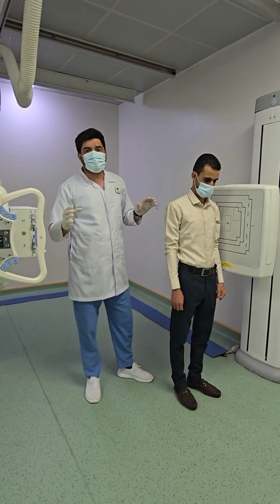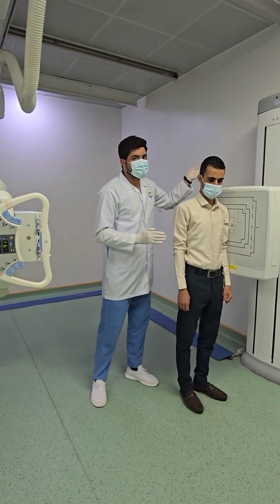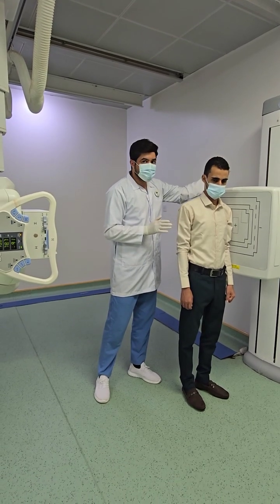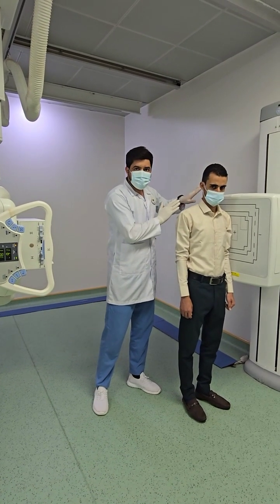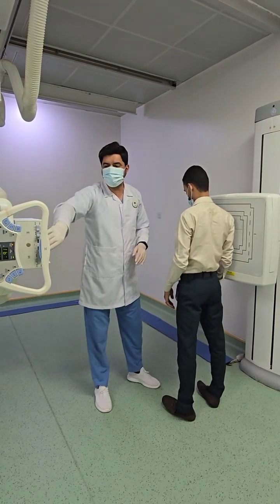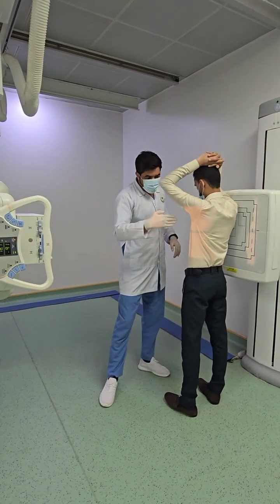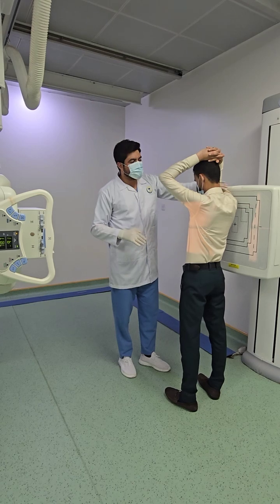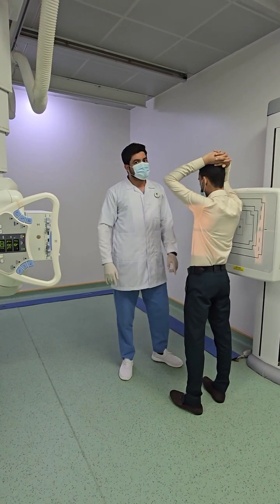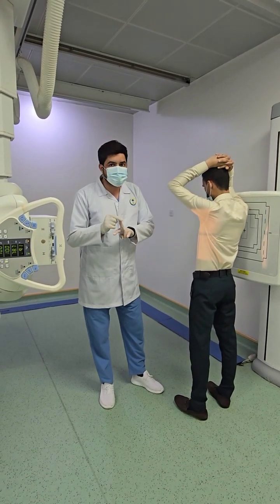X-rays will enter from one side of the body and will emerge from the other side of the body. Either it will enter at the right side of the body and will emerge at the left side of the body and then will interact with the detector, or the X-rays will first interact with the left side of the body, then will get inside the body and finally will come out of the right side of the body and will interact with the detector. So we have two views in the lateral. One is right lateral, other is left lateral.